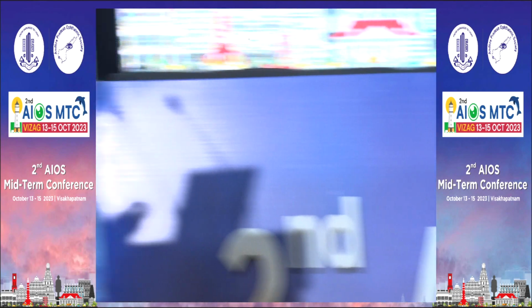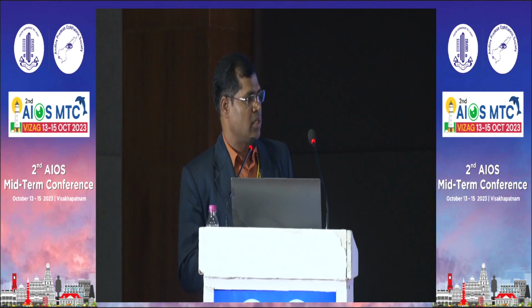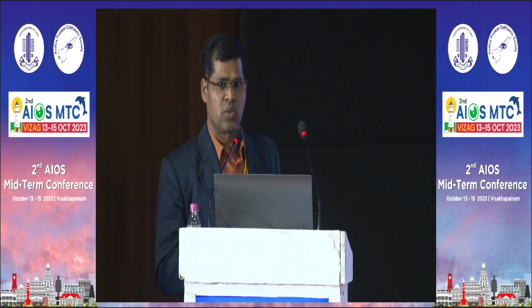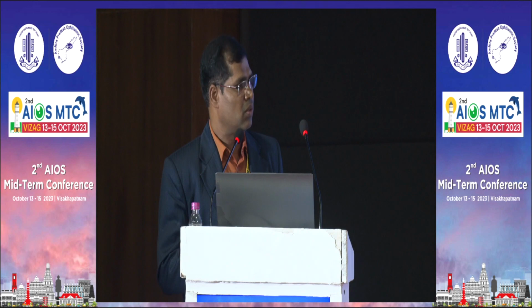we should not aim for the anatomical closure. We should aim for the functional closure. For functional closure, unless there is an intact ISOS junction, the patient will not have an improvement in vision. Otherwise, even if the macular hole is anatomically closed, the patient will not have improvement in the vision in chronic or large macular holes.